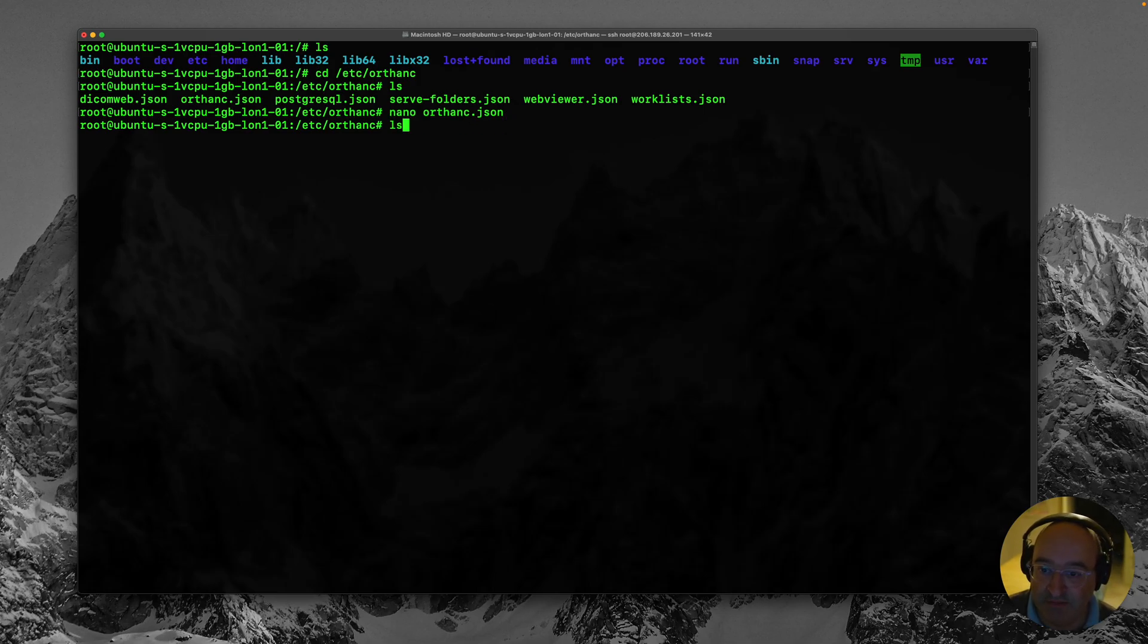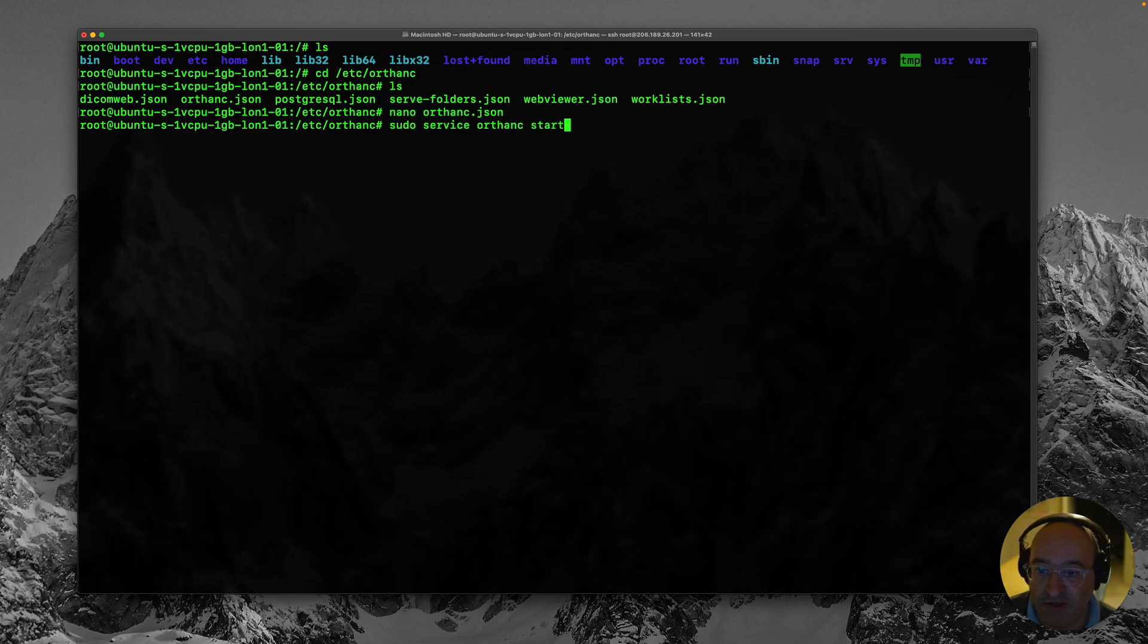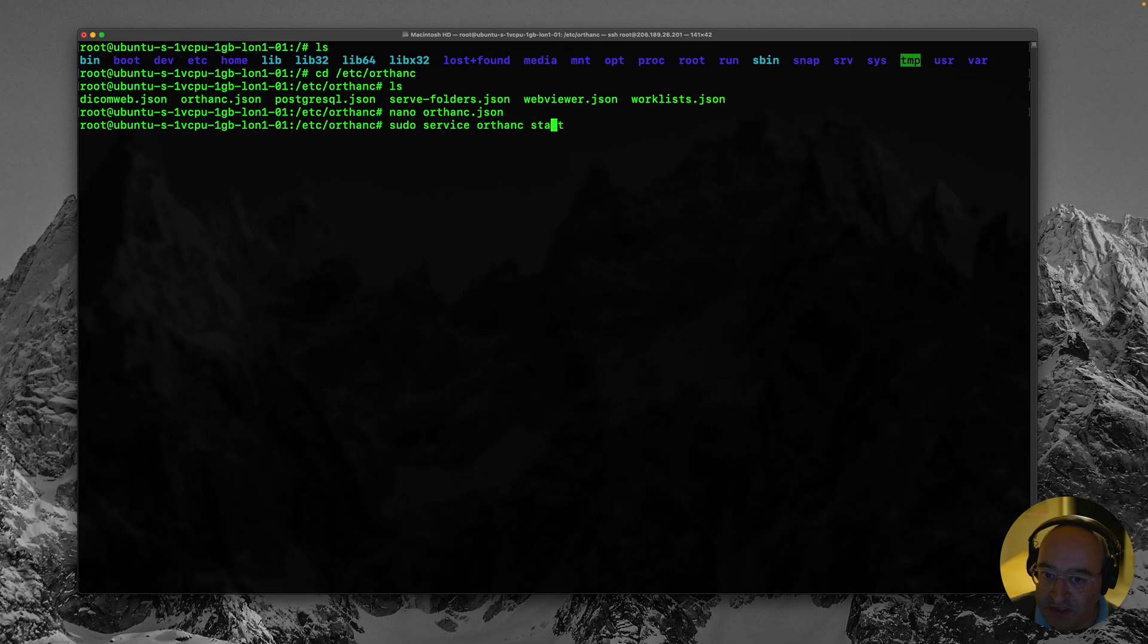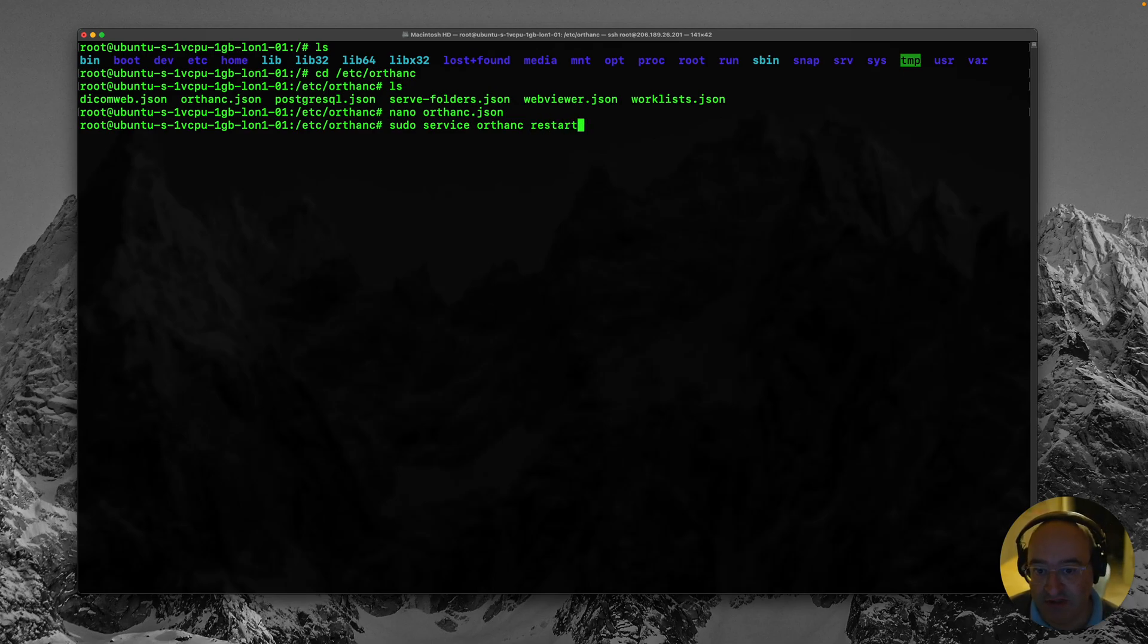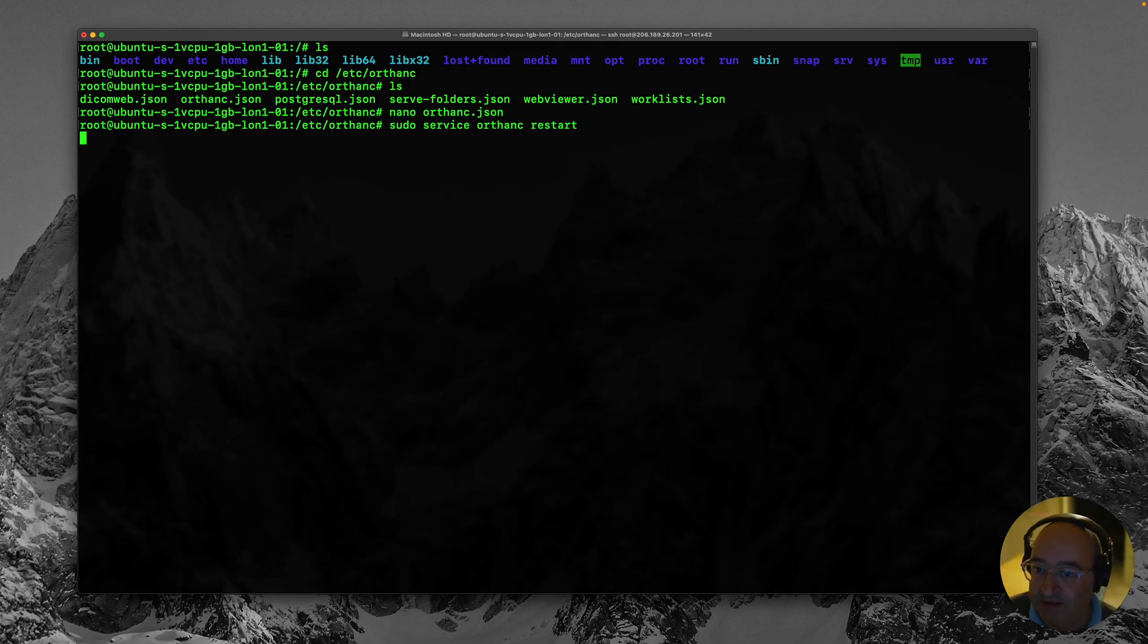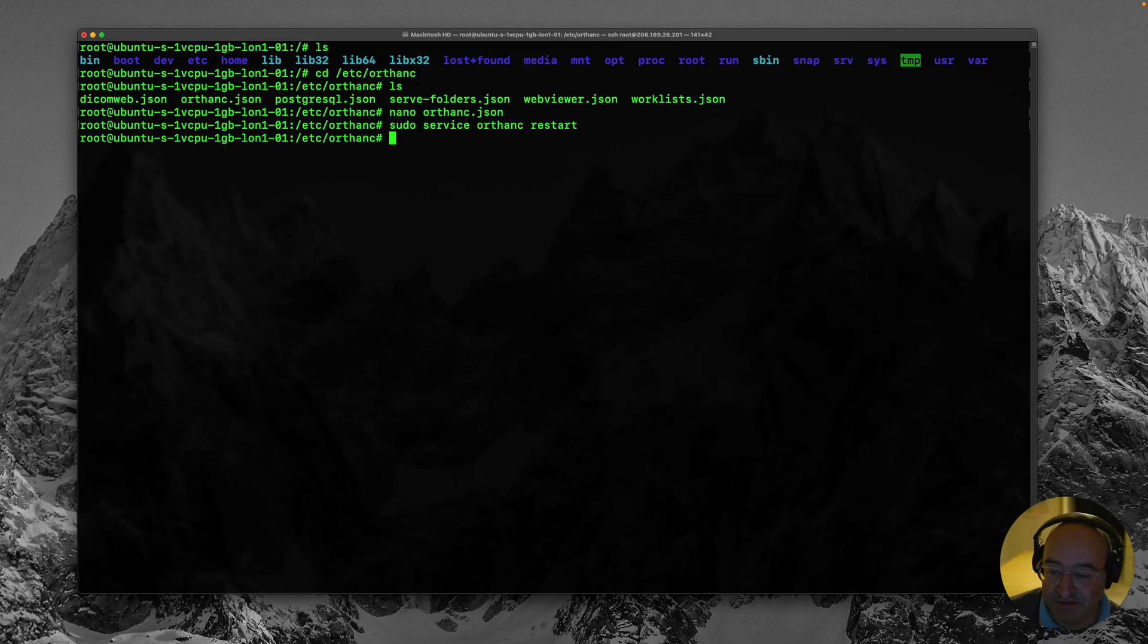So if I just use my up key. I cycle back through my old commands. And you'll remember this one. Sudo service Orthanc start. And that there was a restart to restart the server. So let's just try that. Again a very ungratifying response. But let's see if it's worked.